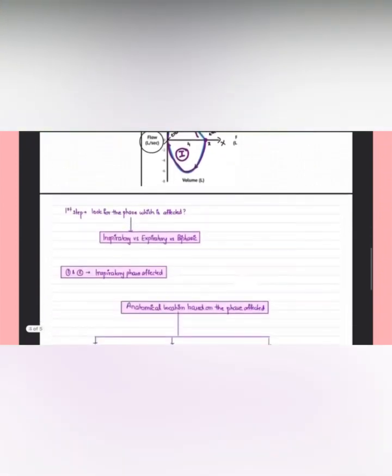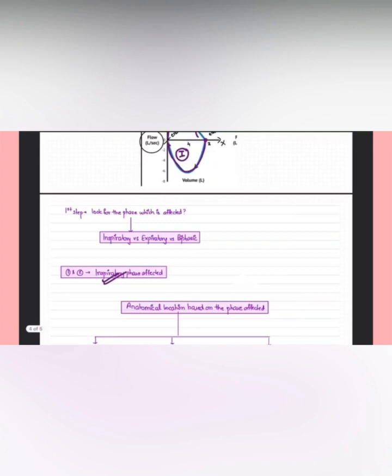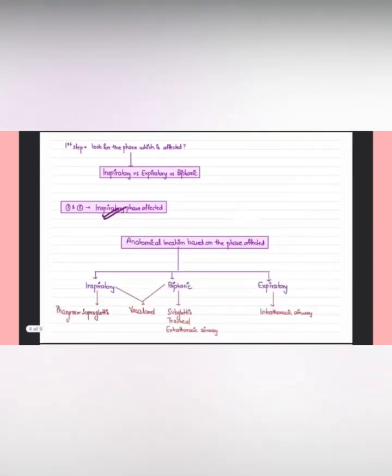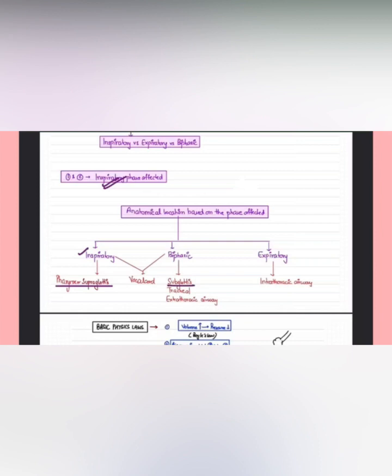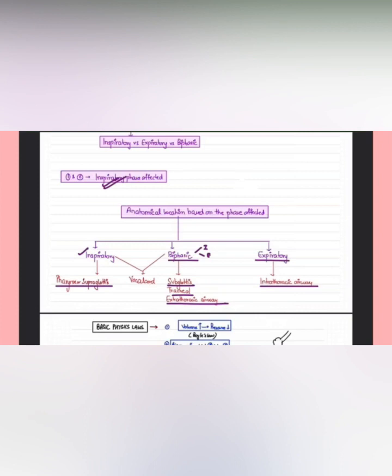The conclusion from history and the loop is that the patient has the inspiratory phase affected. We check which phase is affected because different anatomical locations of the airway are affected differently. If the patient has a problem in the pharynx or supraglottis, the inspiratory phase is affected. If the problem is in the subglottis, trachea, or extrathoracic airway, the biphasic phase is affected — both inspiration and expiration equally. If there is a problem in the intrathoracic airway, usually the expiratory phase is affected.